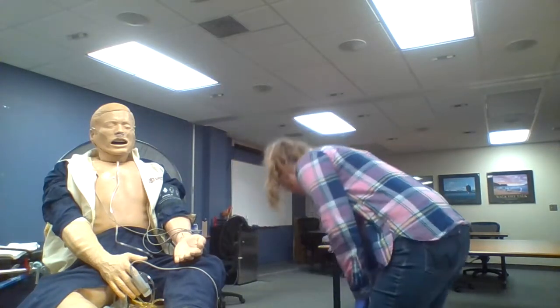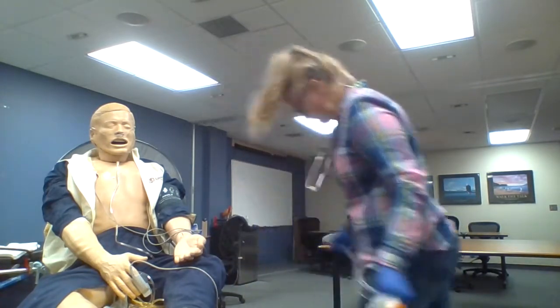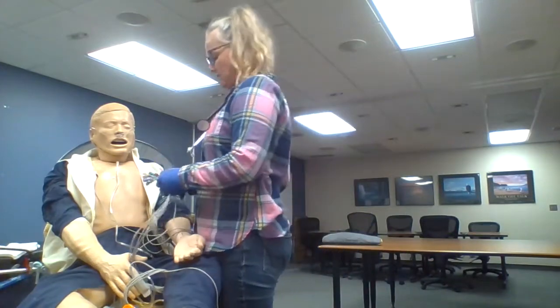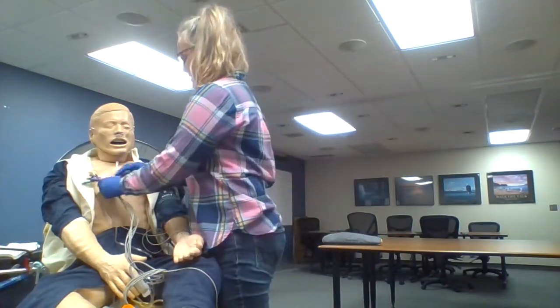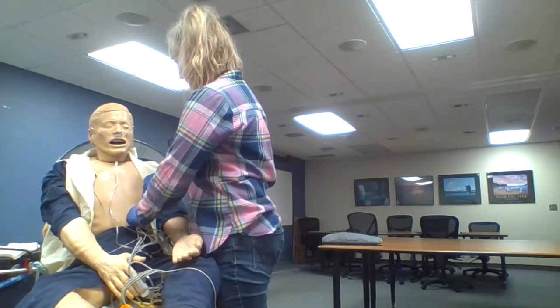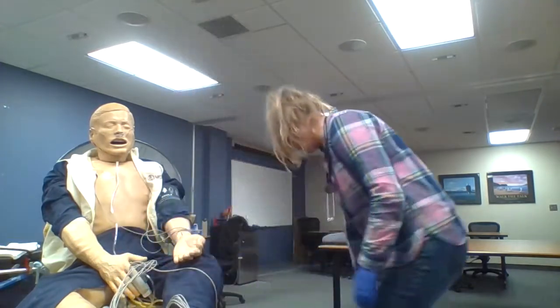So first thing I'm going to do is a quick test on your heart here just to make sure that you don't have anything going on. I see that you do have a pacemaker, but we'll do an ECG anyways. So this is a 12-lead ECG just to do a picture of your heart, okay? There'll be a bunch of stickers that come down through here. All right. And we'll check that out for you.